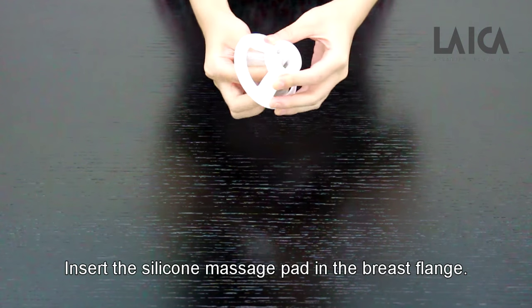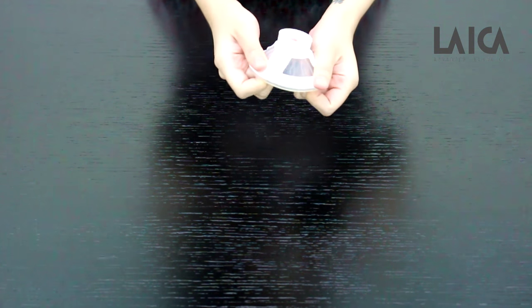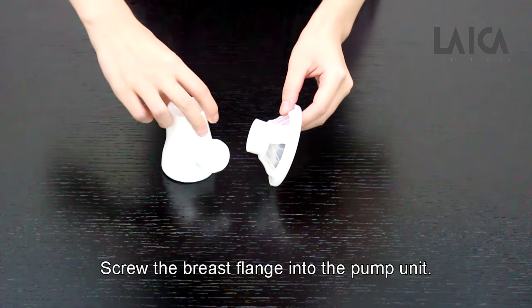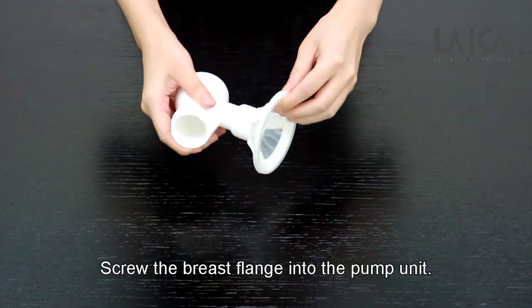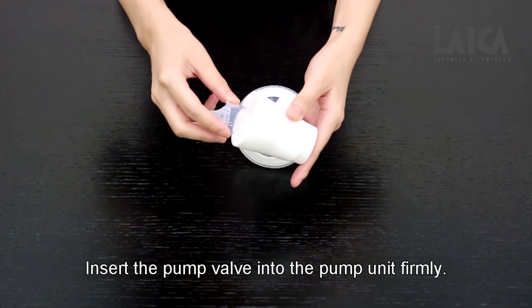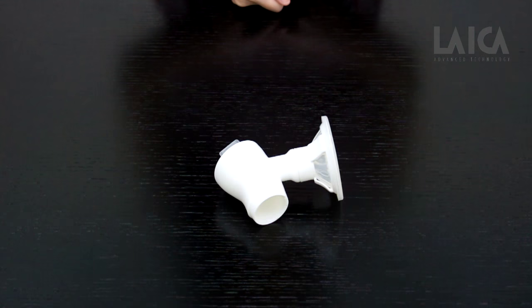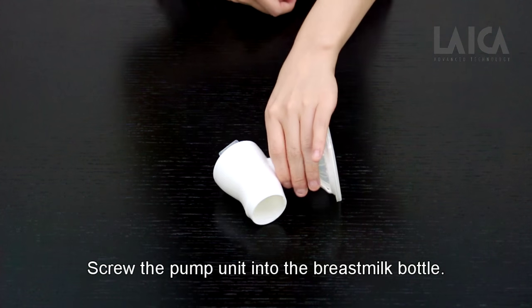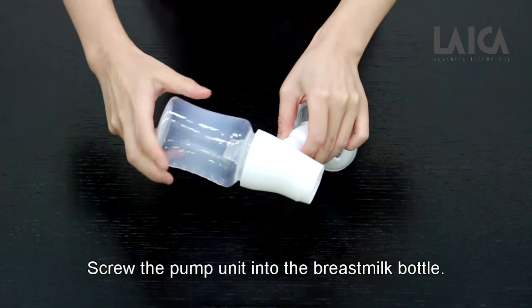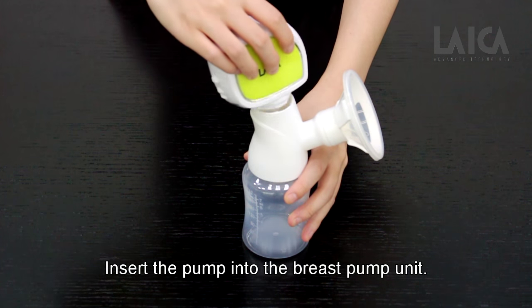Insert the silicone massage pad in the breast flange. Screw the breast flange into the pump unit. Insert the pump valve into the pump unit firmly. Screw the pump unit into the breast milk bottle. Insert the pump into the breast pump unit.